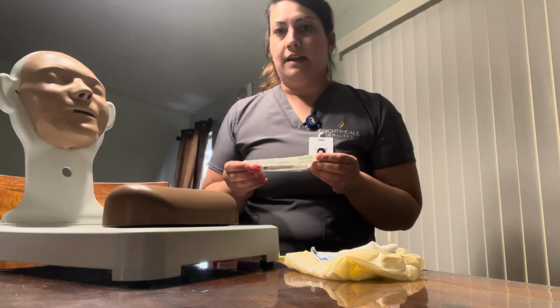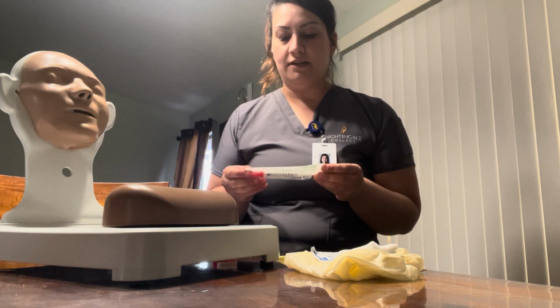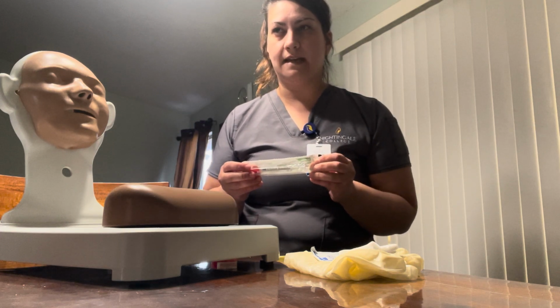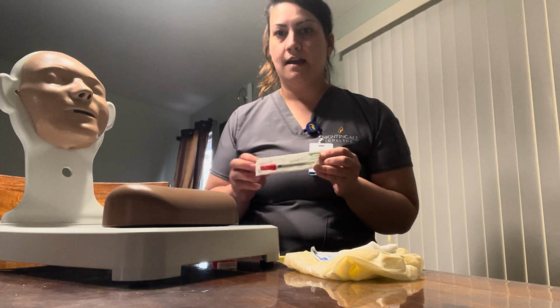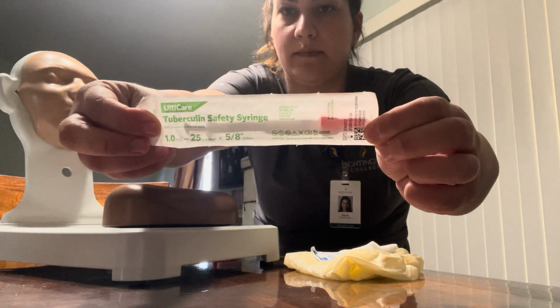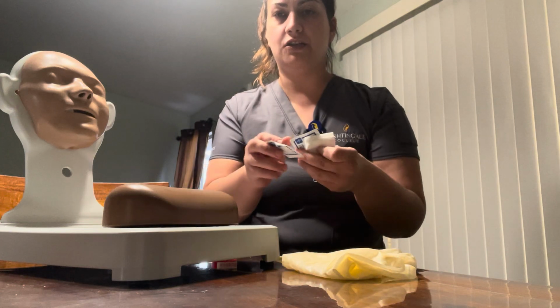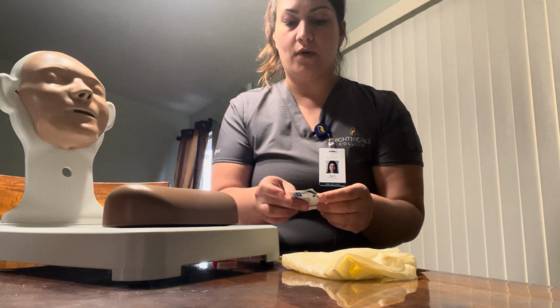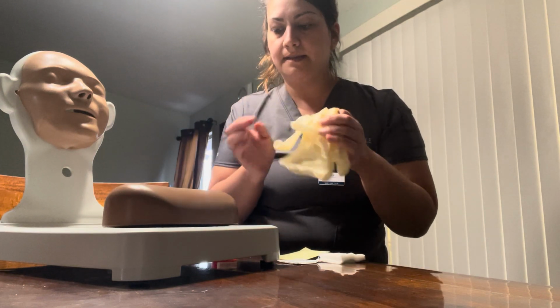It's going to be a 1 to 3 milliliter syringe, with a 5/8 to 3/8 inch needle. And in this case, we're going to be using the one that's in my kit. I also will have my 2 alcohol wipes and my gauze that I can wipe with later. I have my gloves.